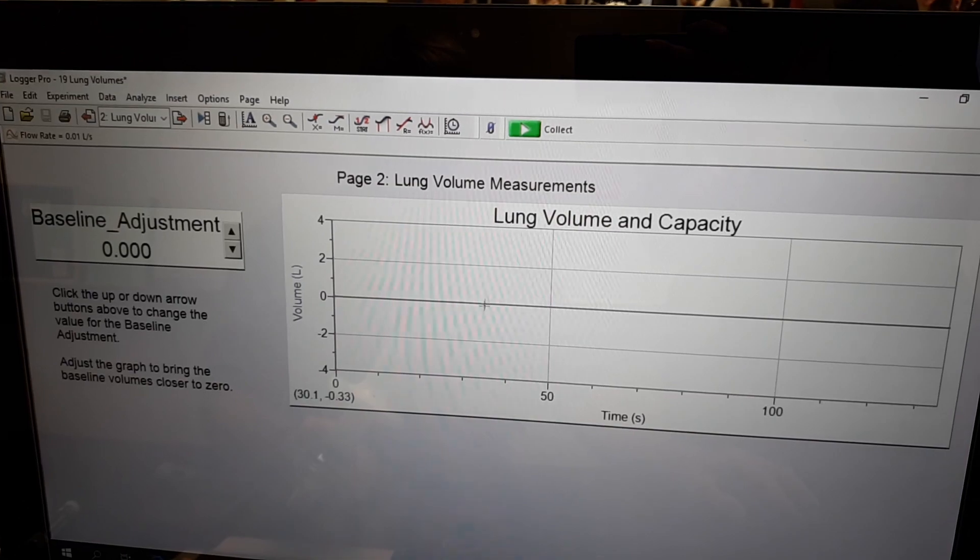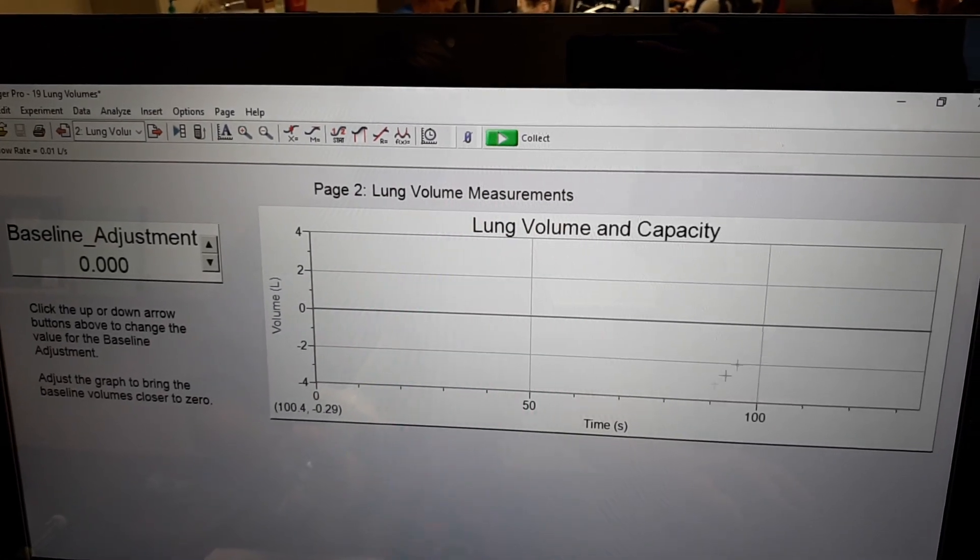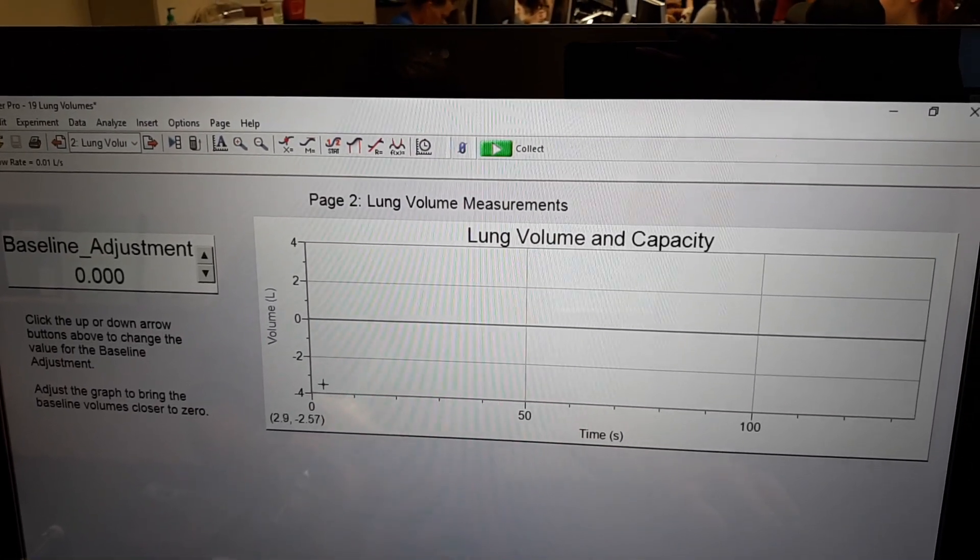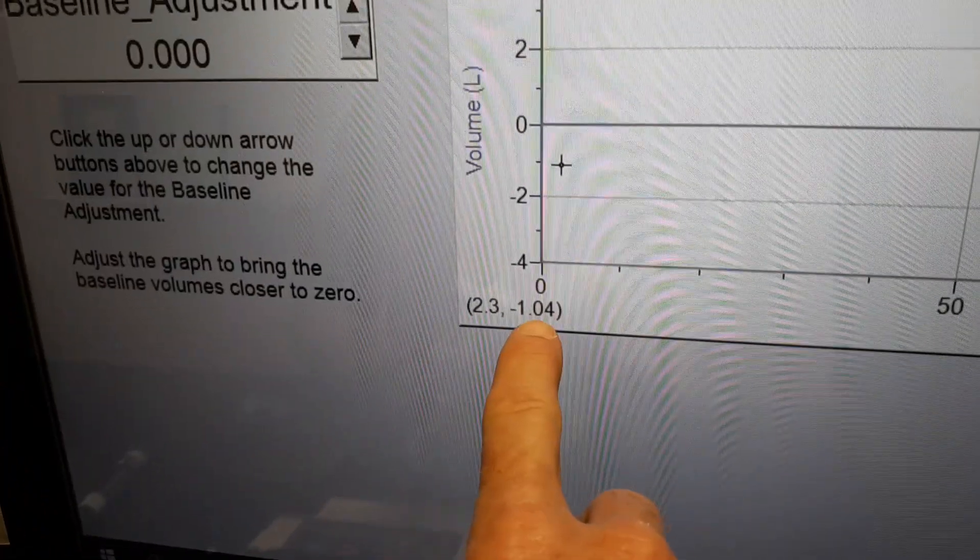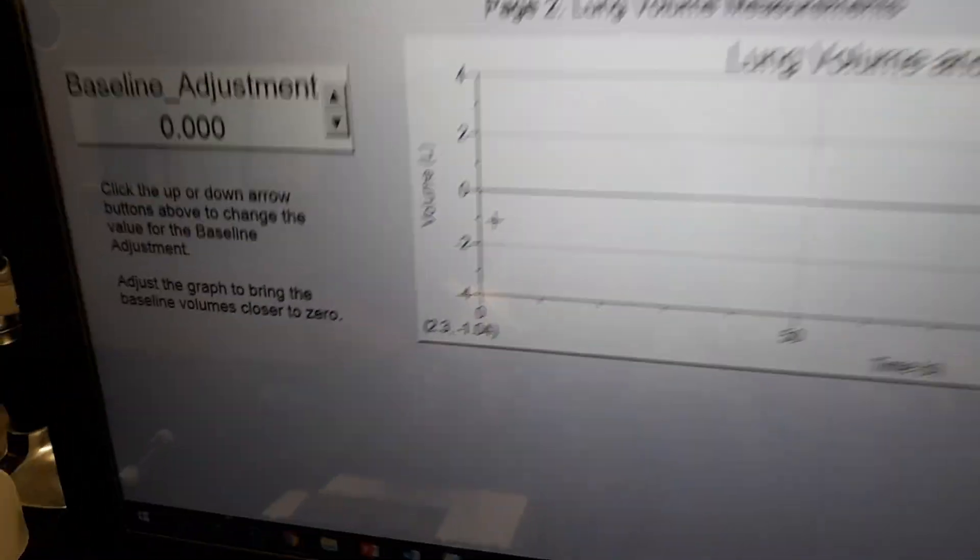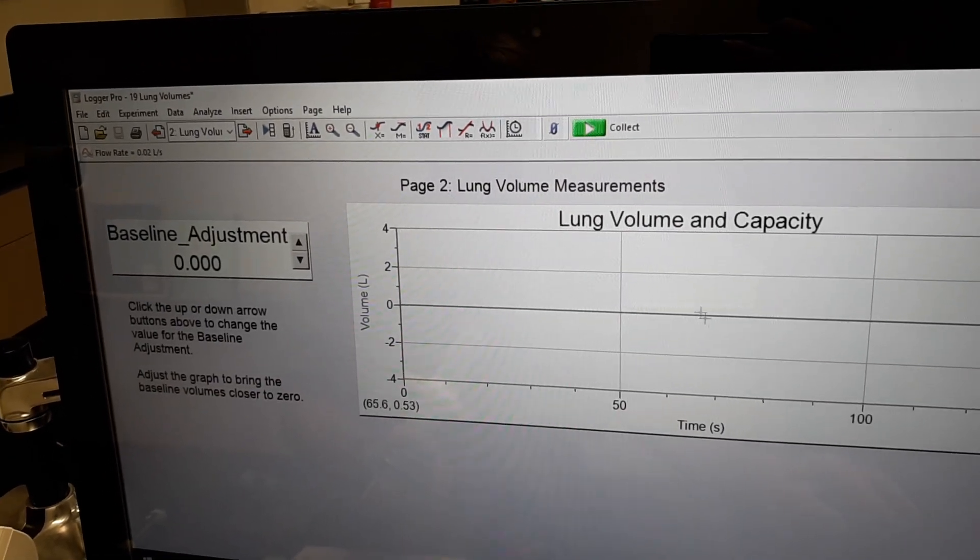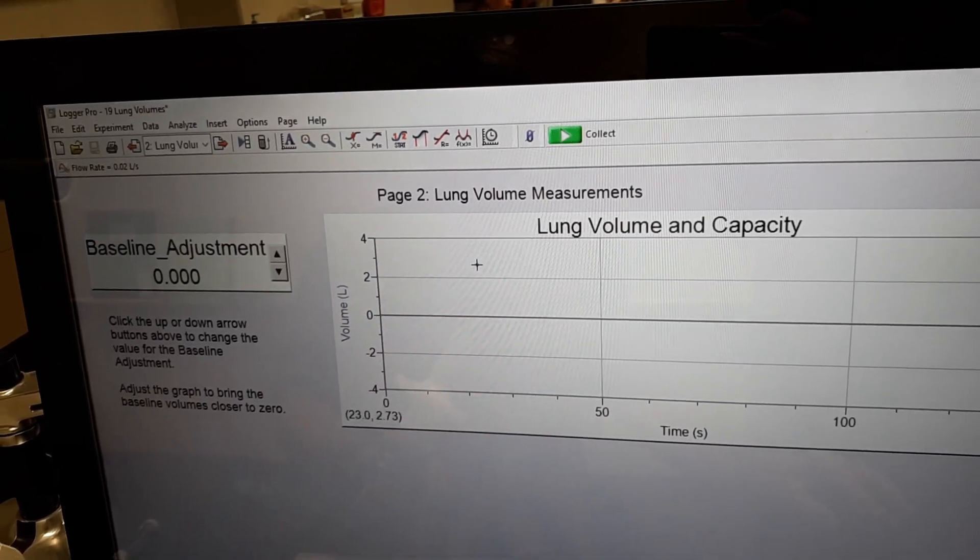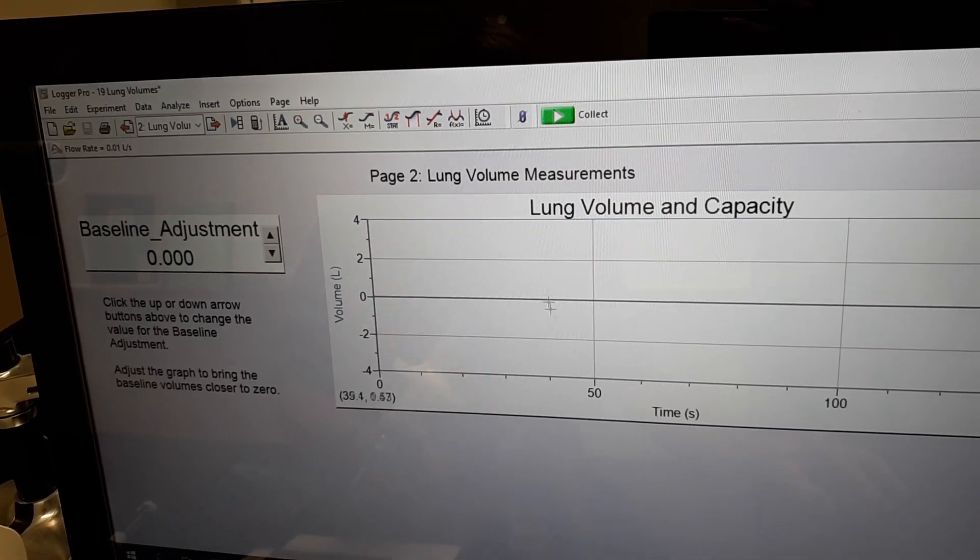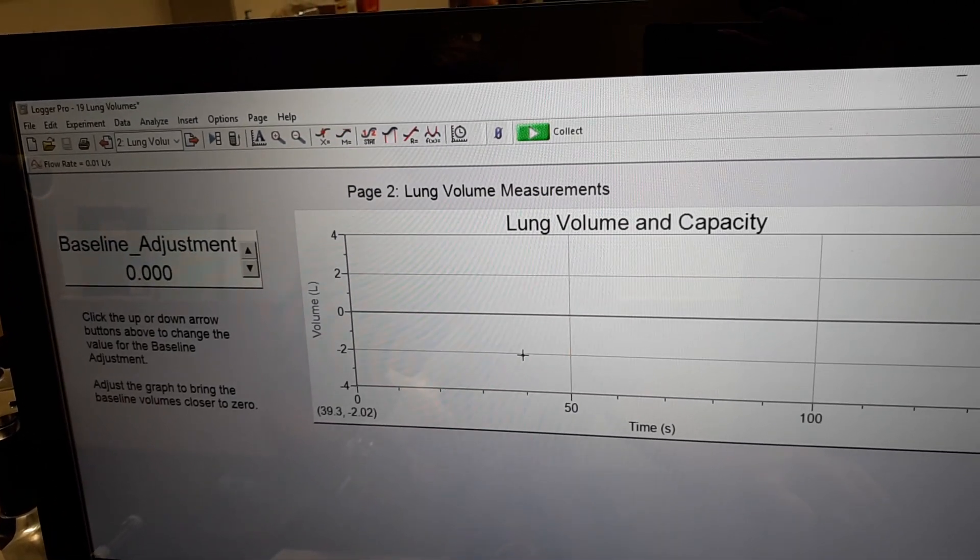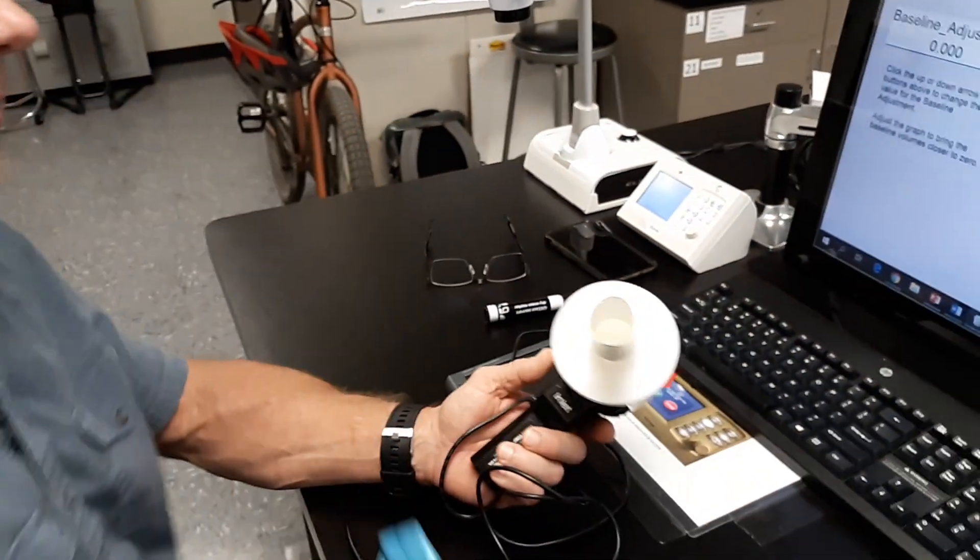You can see as you scroll across here with your mouse, it gives you a reading of time and volume. And so when we get our graph, when we've done our experiment here, you can actually roll over and just kind of hit your peaks and values. We'll show you what that means in just a second. All right. So we're going to go ahead and run this experiment.